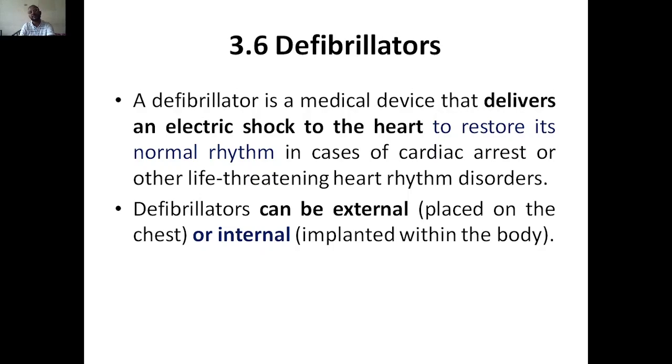So a defibrillator is nothing but a medical device that delivers an electrical shock, a sudden electric shock, to the heart, so that it restores its normal rhythm in the case of cardiac arrest or other life-threatening heart rhythm disorders. If the person is experiencing cardiac arrest, a heart attack, or any kind of life-threatening heart rhythm disorder, then we can use these defibrillators.